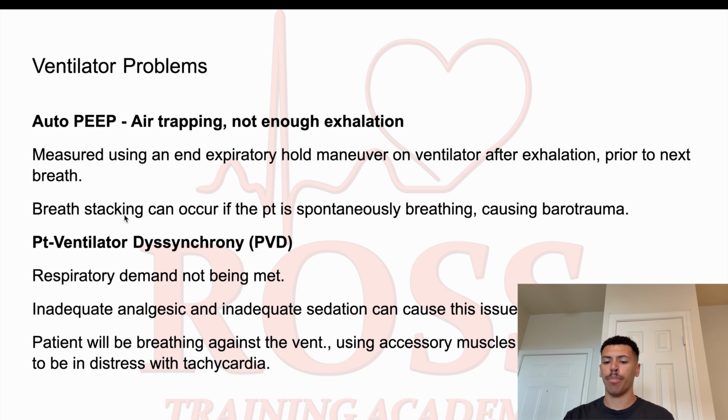Air trapping, breath stacking, this can all occur when the patient is spontaneously breathing, and that'll start causing barotrauma. So this is something that you will actually be able to see on the ventilator. Depending on the type of ventilator you have, there might be a graph or some bars that you'll see pop up across the screen, and you'll start seeing the patient start to exhale and then take in another breath, and so that exhale will shoot right back up, and then it'll start looking like stairs going up.